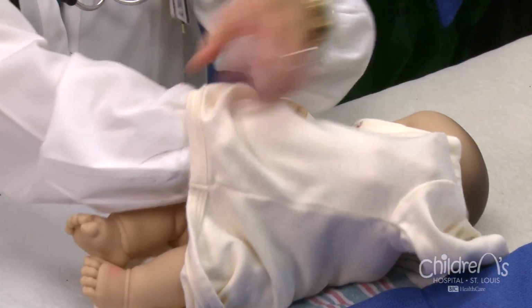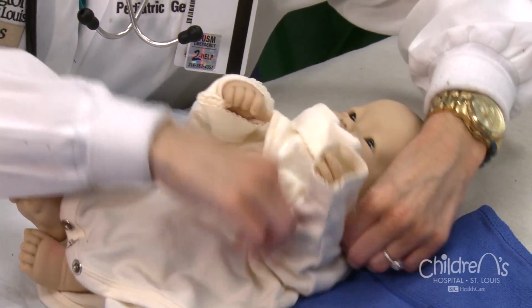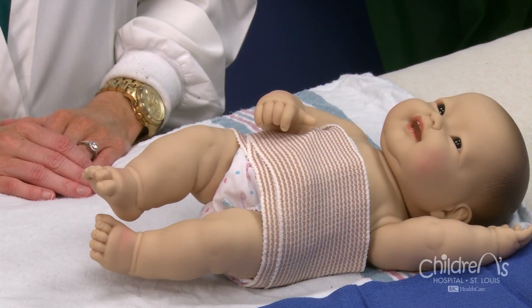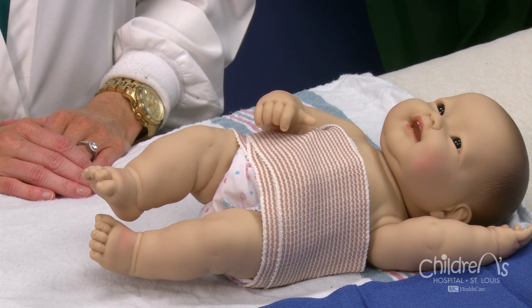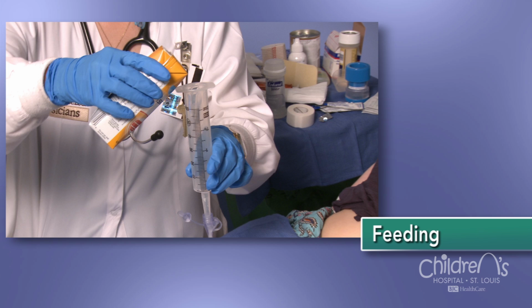First, it is important to prevent the gastrostomy from being accidentally pulled out. In order to prevent this, you may dress your infant in a onesie or place an ACE wrap bandage around the abdomen in active toddlers and children. Before your child goes home, you will be given instructions about a diet and feeding schedule that deliver the calories and fluids your child needs.